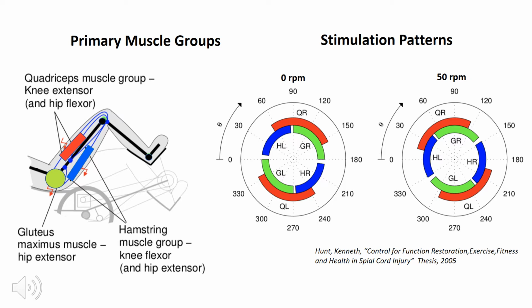So what we learn here is that we have to anticipate the motion. We have to be able to stimulate and anticipate when motion is going to occur and the different time scales that the stimulation will take to effectuate its job. And this will be something very generic to any system that is integrated with an exoskeleton. So I leave you with that as one of the problems, and then I will share you with another problem that is rather generic to muscle stimulation.